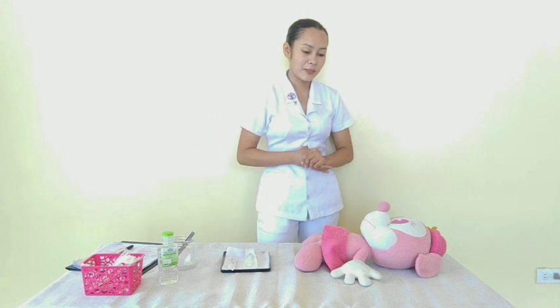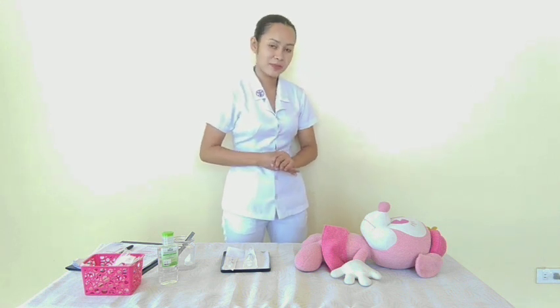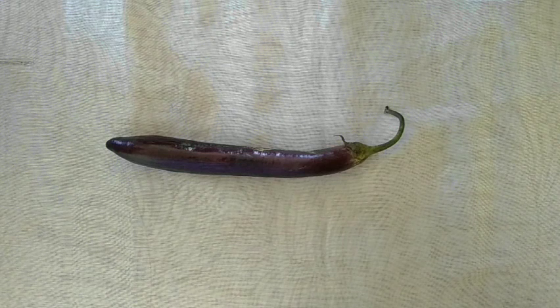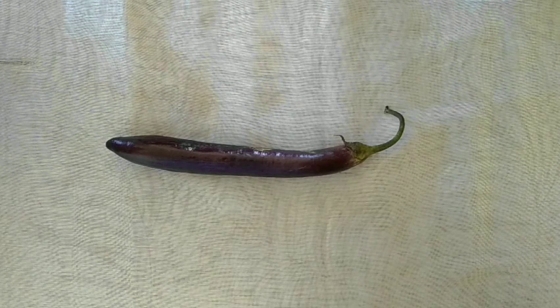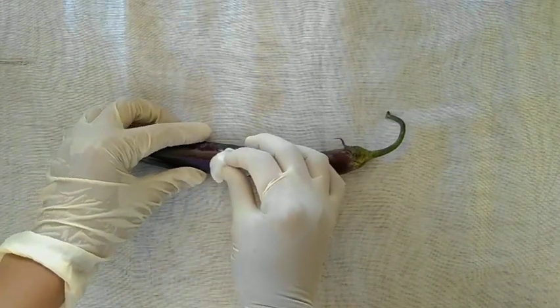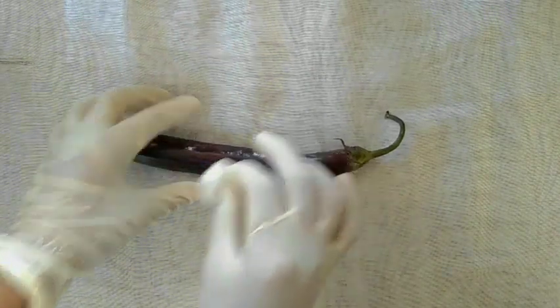Okay. So as you can observe, ma'am, I'm now providing you privacy by closing the door and the curtains. And now I'm going to prepare the medication and assist you in a sitting position. For intramuscular injection, we have to select a site that is free from lesion, inflammation, swelling, and tenderness, and apply clean gloves and clean the site of the injection using an antiseptic swab starting from the center, going outward, and discard. Then prepare the syringe while letting the site dry.